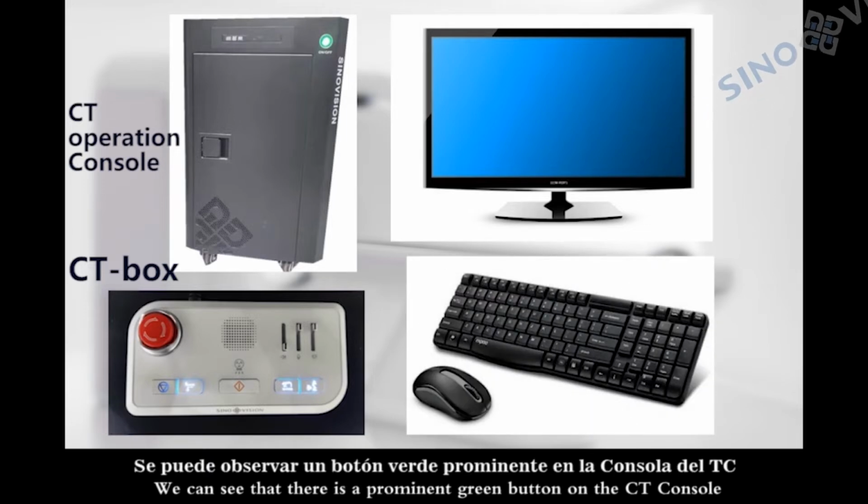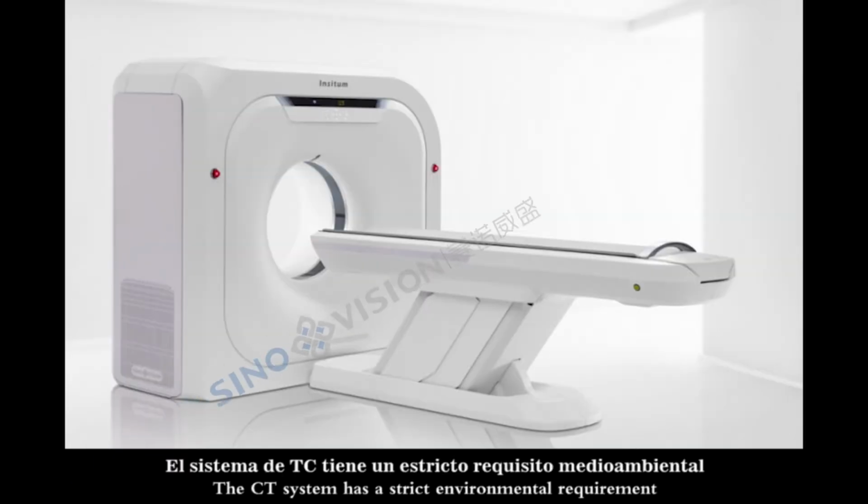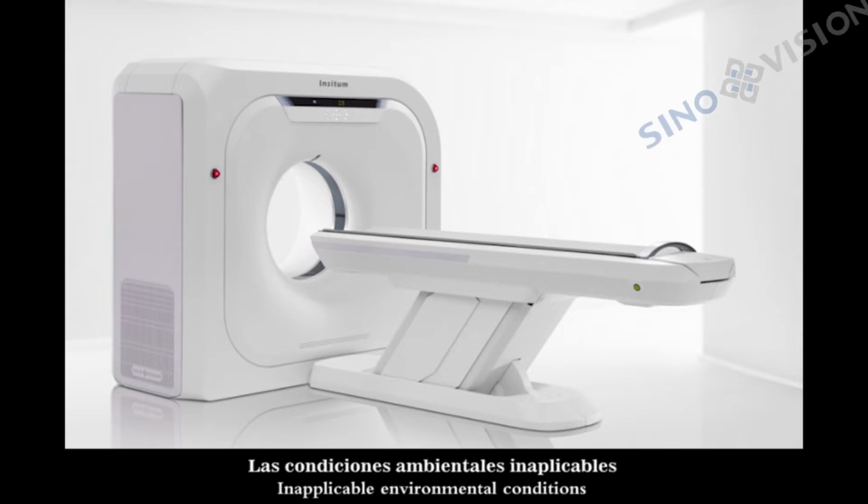We can see that there is a prominent green button on the CT console. This is the main switch to turn on the CT system. The CT system has a strict environmental requirement.